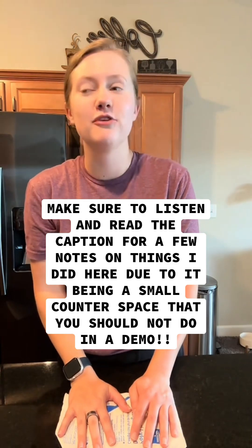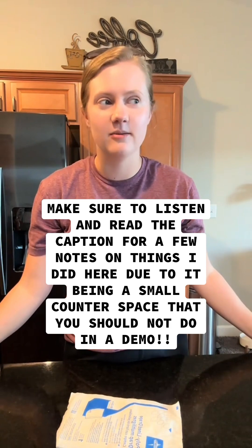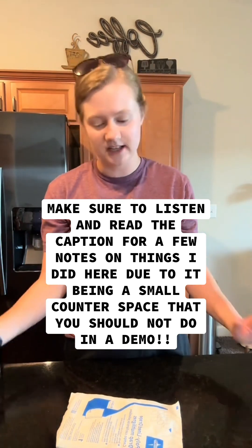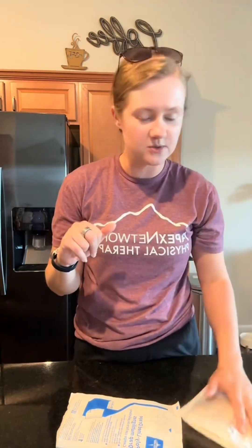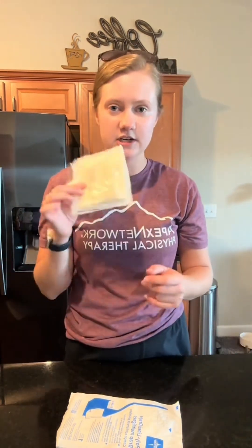I'm practicing my sterile drapes, which is what I've been doing a ton recently. Somebody asked me a question the other day about something from one of our other classes and I was like, I don't know, you want to see my sterile drape? We have a skills check-off this Thursday so I figured I would show you. These are my sterile gloves, which I'm also going to open. This is my drape — it's open because we were practicing with it and I only have one more to use for my actual skills check-off. We were also practicing putting gauze on it once it's open.